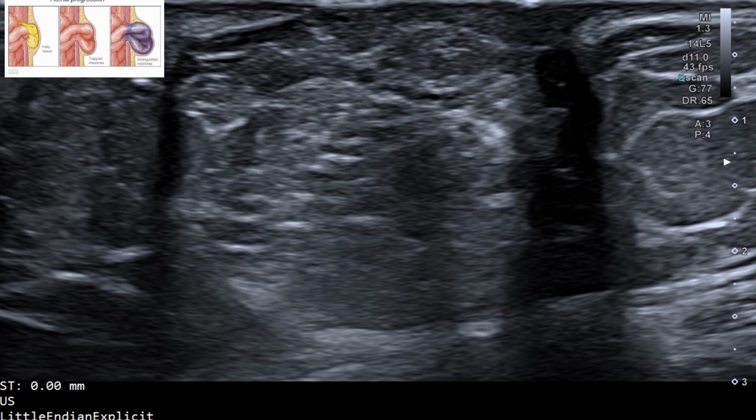So what we have here is a defect. You can see there's a defect there, this is the defect there. So this is the defect that we have. Let me trace it nicely. So we have got the defect there.